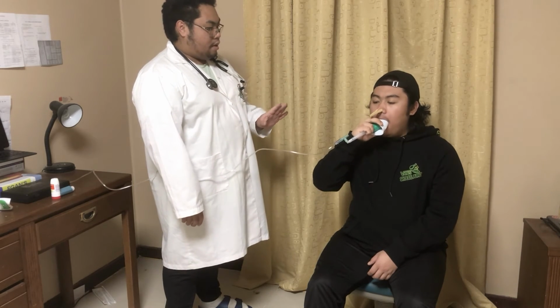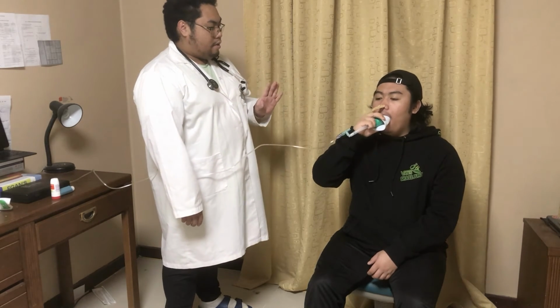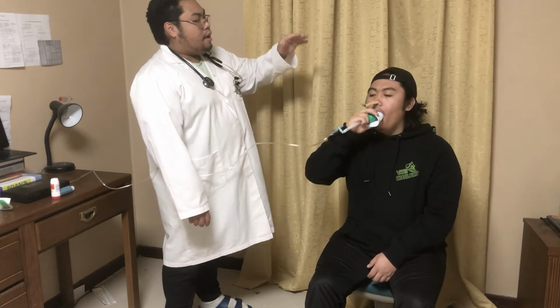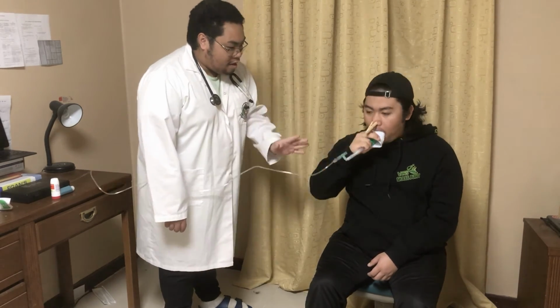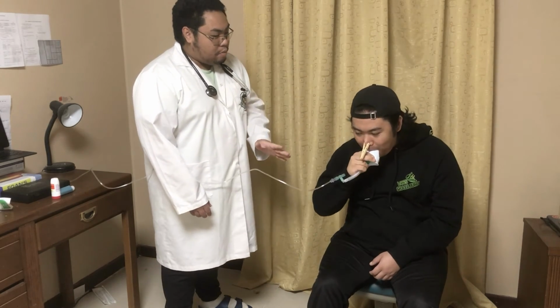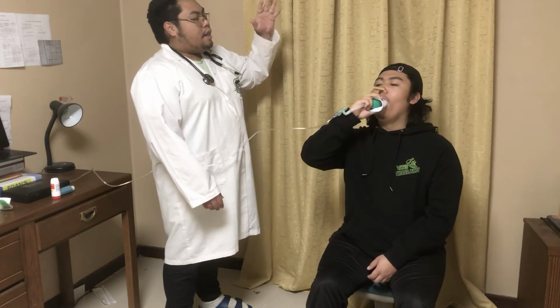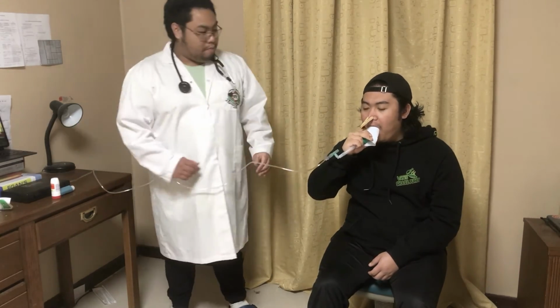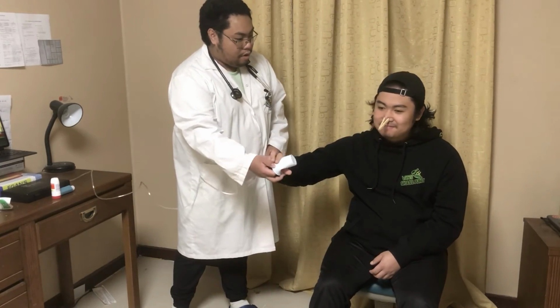Inhale, exhale. Inhale, exhale. Inhale, exhale. Inhale, exhale. Inhale, exhale. Blow. Inhale, exhale. Okay, sir, the test is over. That's good. How are you feeling, sir? Are you feeling alright? Yeah, it's alright. Okay, give me your nose, please, sir.